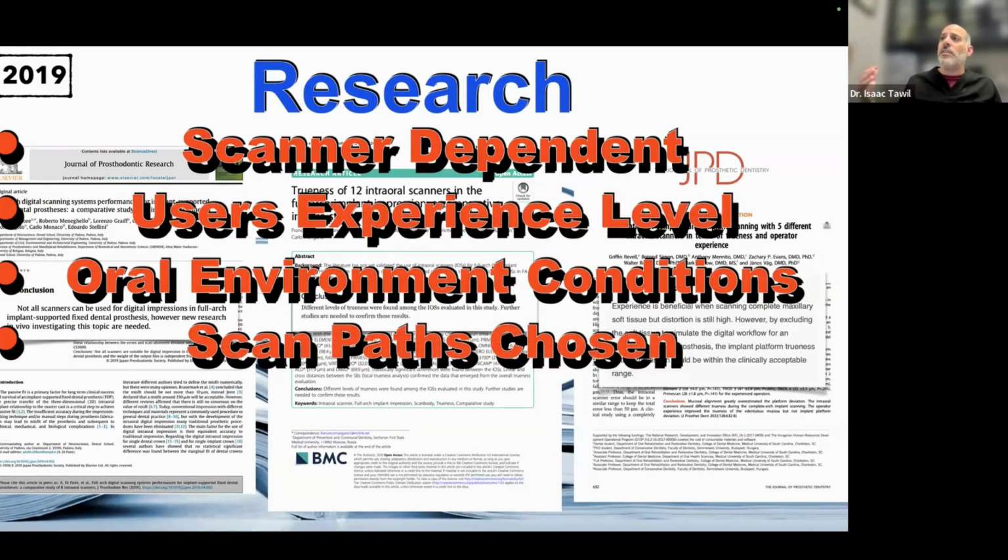And for me, I see all these videos of scan paths and they say, just scan the occlusal, then go to the buccal, then go to the palatal or lingual. That's actually not the right way to scan. Depending on the scanner, most of the scanners will stitch pretty well, but you want to give it as much field of view as you can. So as you're scanning, you're rotating the scanner around on the buccal and lingual, so you're capturing a little bit of each, so that when you do stitch, it will stitch and merge better.